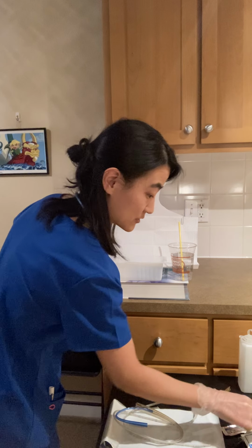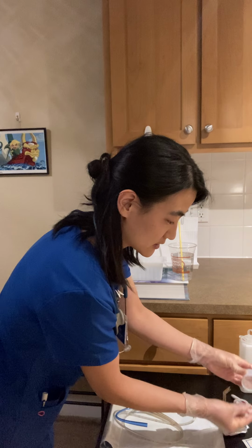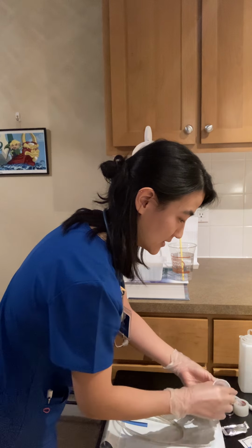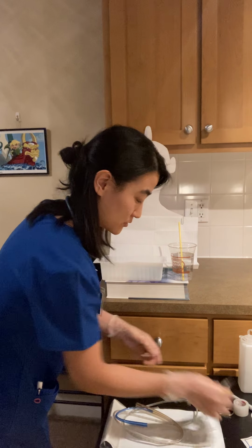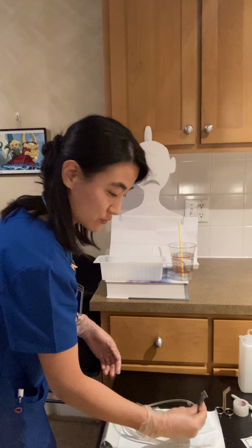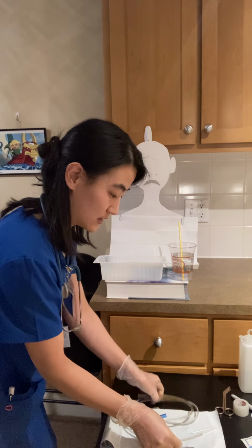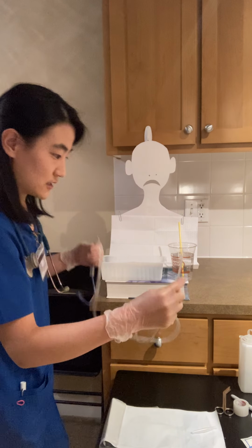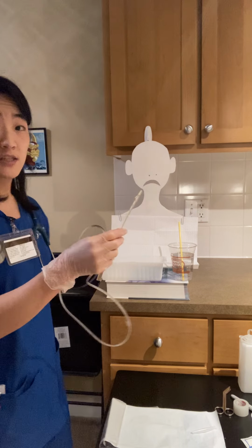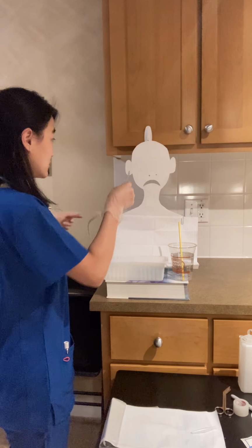Alright, so after setting up the communication and getting him ready for the instructions, before we proceed, I'm going to coat the tip of the nasogastric tube in lubricant, and then I will begin to insert the nasogastric tube into the nares. Alright, Mr. Nguyen, here we go.